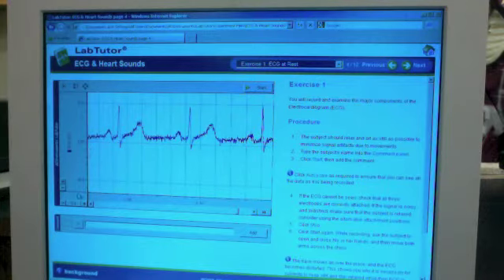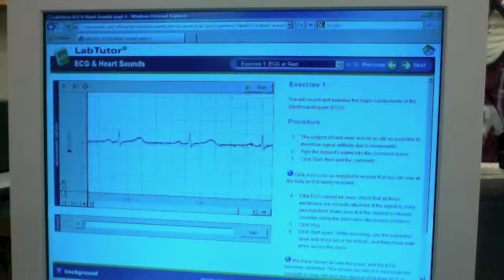On the other hand, I may come to a case in which the signal is really large and it's off the screen. So let's imagine that I have the screen set up like this, but then I measure something that's 2 millivolts. Well, it's going to be up at the top of the screen. I can't even see where the top of it is. So in that particular case, I want to take negative down and scrunch it. So again, all I'm really doing is changing the scale.